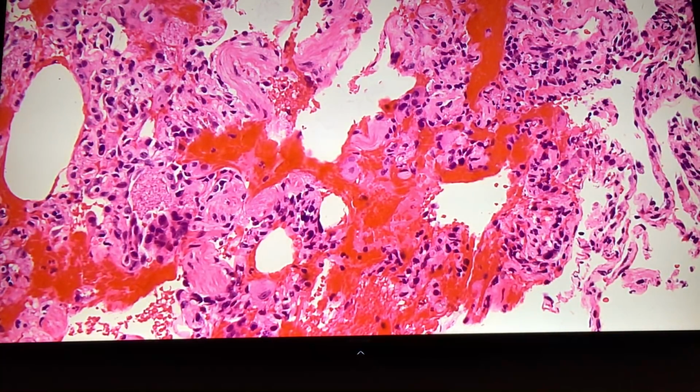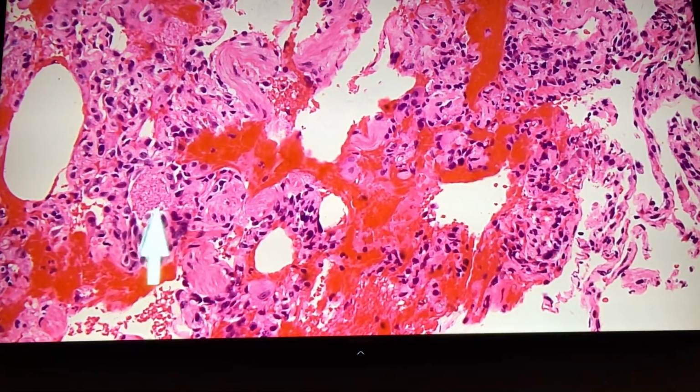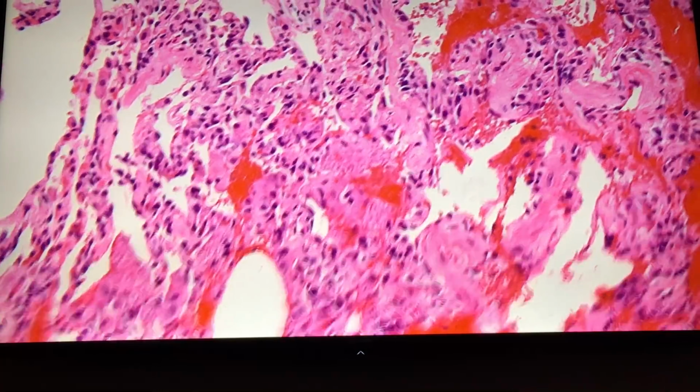See how the PAP was? It was just obvious. Everything was filled. And they say that PCP and PAP are differentials of each other, but they look very different. This material, so I'll just bring it in and see if you can find it. Bring this to the center. And there's one at the top too, see there? Bring it to the center so we can look at it more carefully, and at a higher mag.